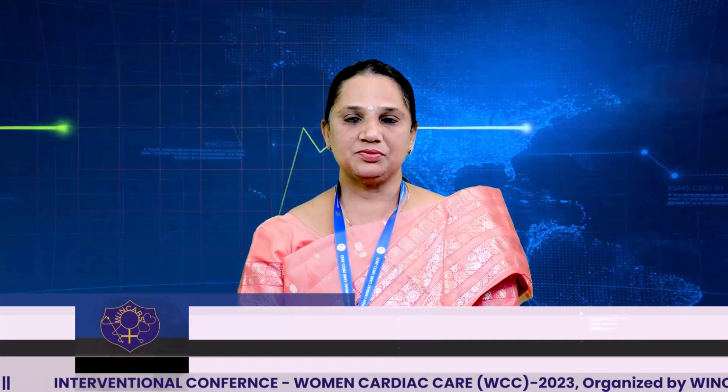How is it different from the rest of it? You inflate it only to 4 atmospheres and it acts on sonic waves which are converted into mechanical energy, and they produce cracks on circumferential calcium, and they result in a preparation of the lumen, after which you can use a non-compliant balloon further on and you can deliver the stent appropriately.